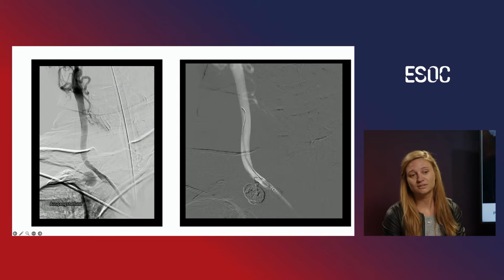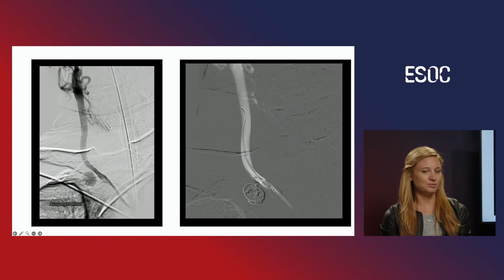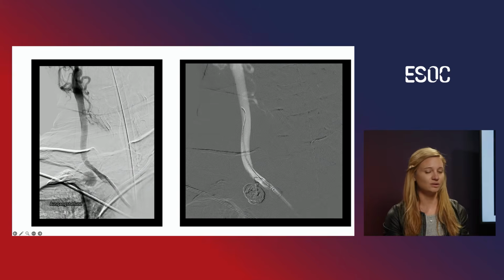So we decided, okay, then we try coiling of the aneurysm. And then we decided to use a balloon guiding again to bring it in the common carotid artery to have, again, the embolic protection, because when we insert the coils, there's so much embolic material that we feared to mobilize that and did not want to generate a stroke. So in this procedure, did you aspirate through the balloon at that time for this occasion, or just passively place the balloon? We always open the back valve and then allow backflow, passively, so that all the fragments we possibly mobilize go back.